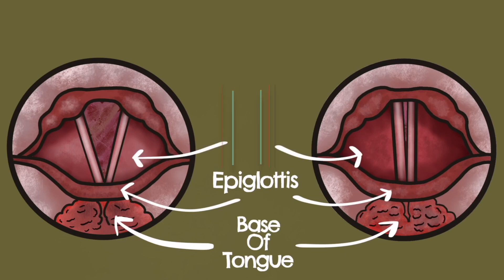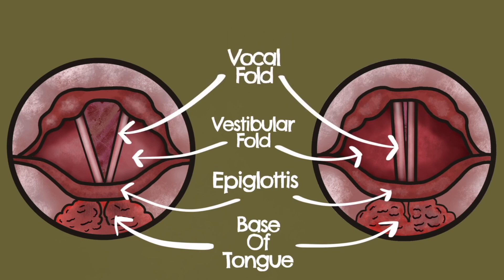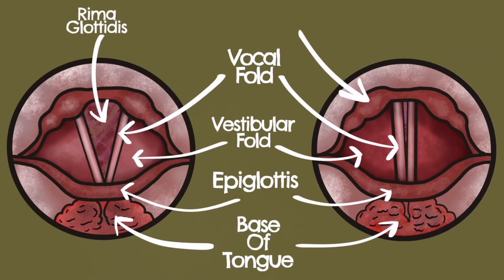We can also see here the vestibular folds, also known as the false vocal cords. They are folds of mucous membrane that enclose the vestibular ligaments. Here are the vocal folds themselves — the true vocal cords. They are twin infoldings of mucous membrane that vibrate and modulate the flow of air expelled on phonation. Let's now have a look at the rima glottidis. This is the opening between the true vocal cords and the arytenoid cartilages. The arytenoid cartilages are a pair of small three-sided pyramids to which the vocal cords attach to enable vocal cord movement.